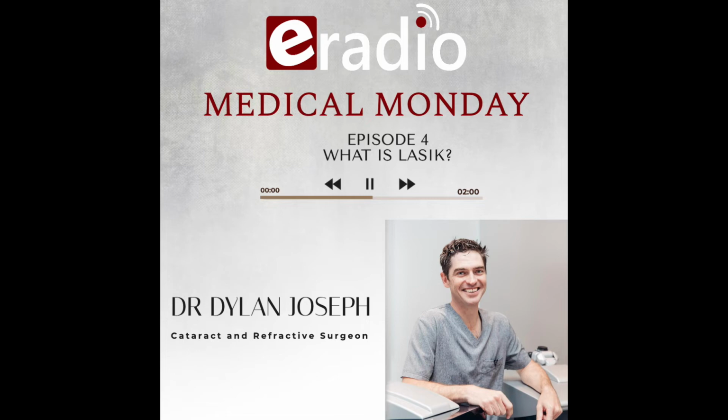So yeah, there have been improvements in the tracking capabilities of the lasers as well. As I said, you can track in all the dimensions, and there's rotational capability as well. And if you've got a large amount of what's called astigmatism, which is that rugby ball shape of the eye, then it's really important that the machine is tracking you to make sure that it delivers the pulses on the exact axis of your eye to take care of all that astigmatism. Because if it couldn't know exactly what the position of your eye was, then it's going to potentially deliver those pulses off center, so to speak, and not correct all your astigmatism or your short-sightedness or your far-sightedness.